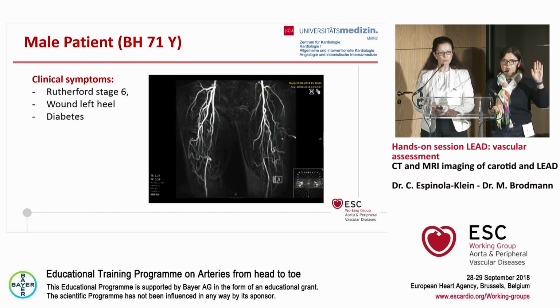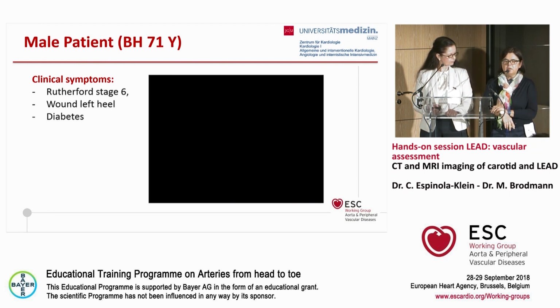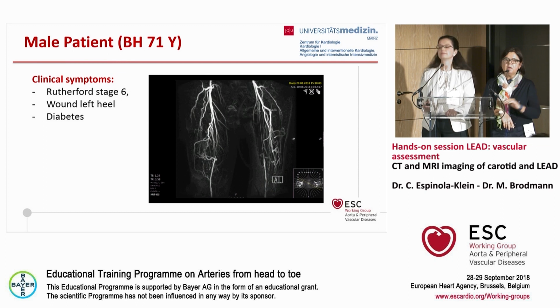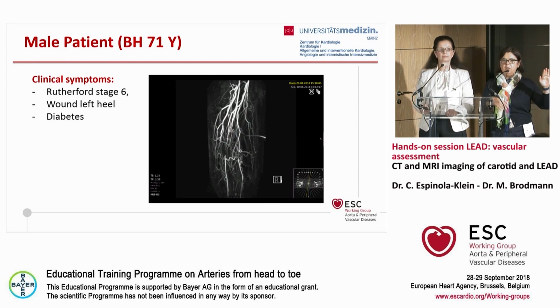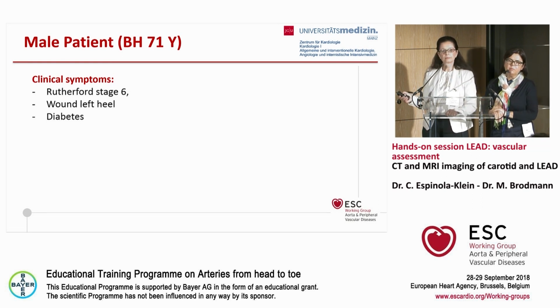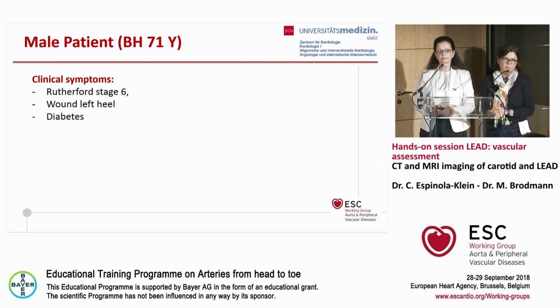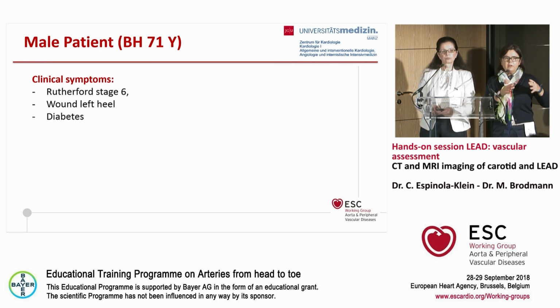And one principle for CTA compared to MRI, especially in patients with critical limb-threatening ischemia, is the outflow. So you have a better insight with the MRI than compared with the CTA. Mirel? Usually our surgeons don't like MRI because they want to see the calcifications. They prefer CT scan. That's true, but you do not have an insight in the outflow. So the outflow is very poor in CTA angiography.